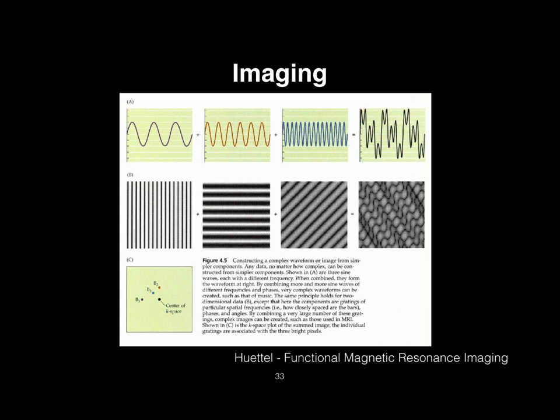So Kx is essentially encoding the frequency, and then Ky is encoding the direction of the waveform? That's actually encoding another property of the waveform called its phase. Because these things have both an amplitude and a direction, one dimension encodes how fast it's going, and the other direction encodes the actual position that it ends up as.